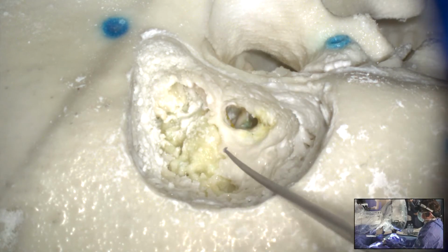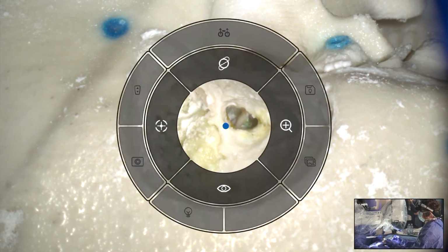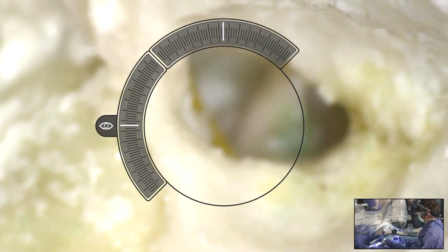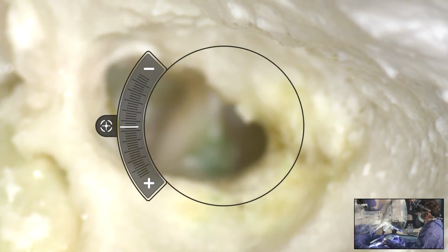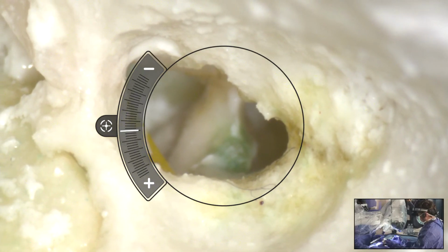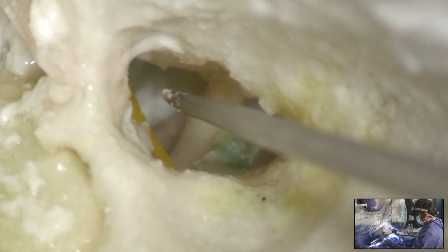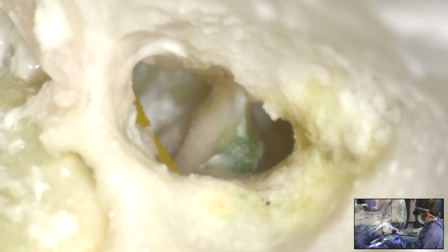Yeah, and what you else can see is here the stapes. This is the stapes. And it's very easy to get into the surgical field with a maximum of zooming in, and now I sharpen the picture. Now you have a perfect view. So this is the tendon of the stapes, the green here. This is the facial nerve, and this is the stapes. So perfect view.